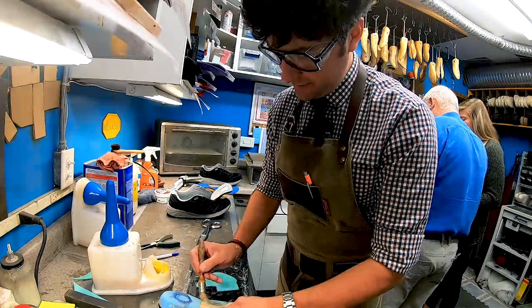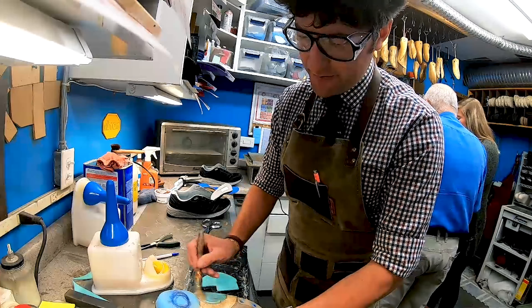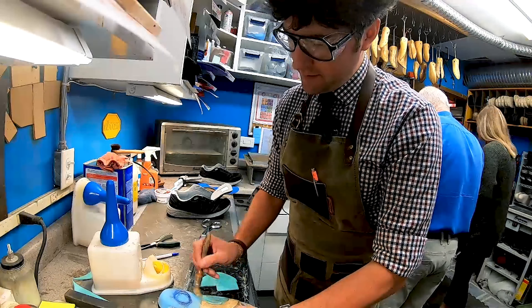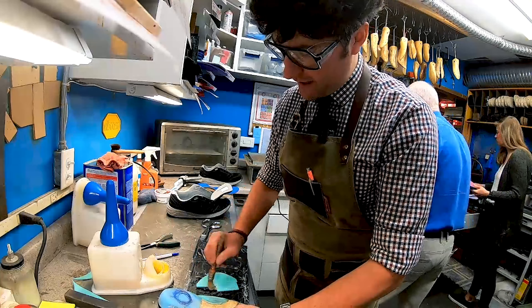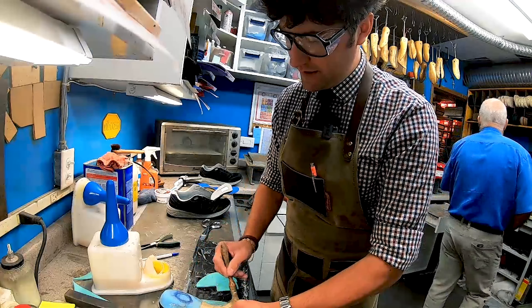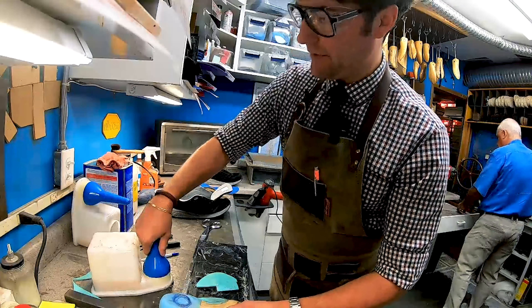Contact cement requires both sides to be glued and usually a couple of minutes to let it dry. You don't want to put it on too thick but you don't want it too thin either — spread it out really nicely.